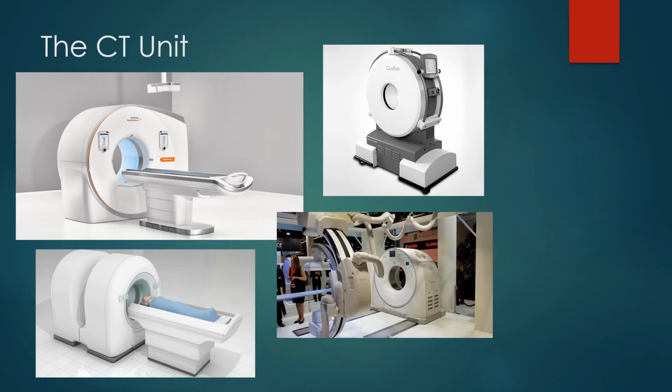Computed tomography technology has made significant advances in the past 15 years. Here are some examples of the different applications currently being utilized in CT. From the upper left, clockwise, first is a conventional diagnostic CT typically used in radiology, but can be used in any application. In the upper right is a portable CT used in emergency applications or intensive care units. On the bottom right, a special procedure CT application, and on the bottom left, a PET CT unit. However, the most important component is the production of X-rays in the X-ray tube.